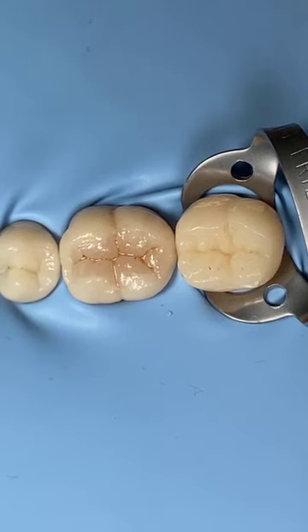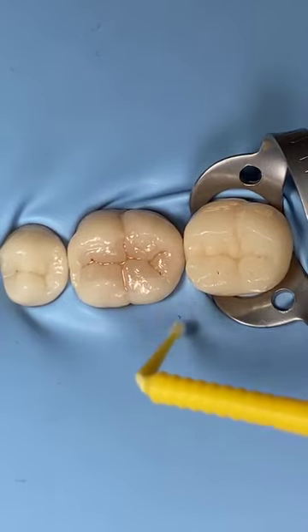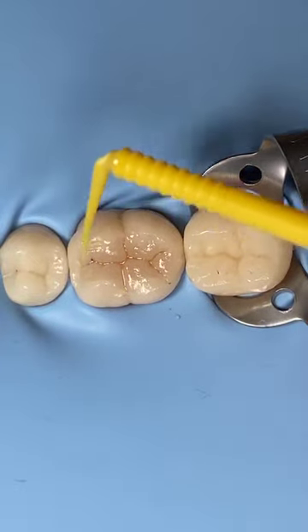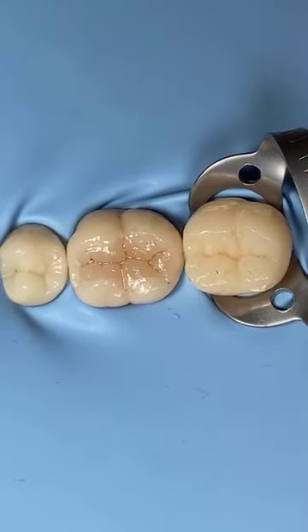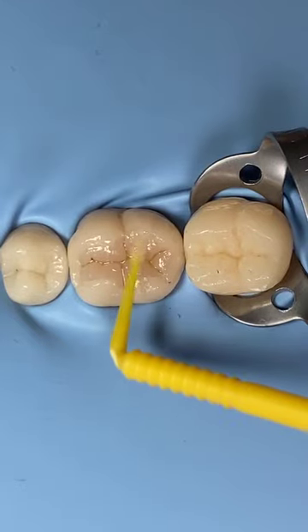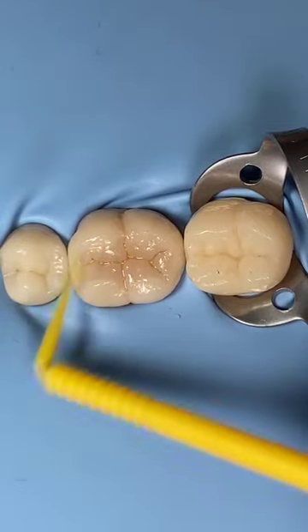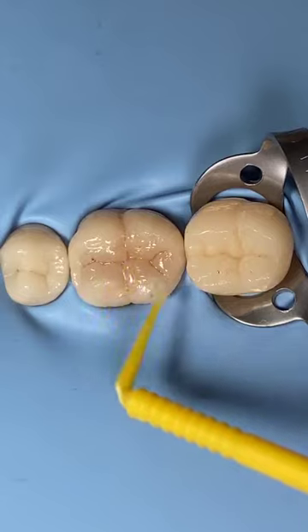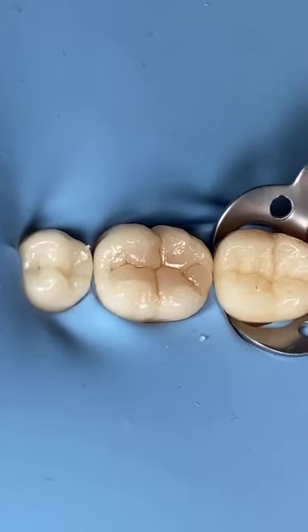Just trying to remove all. Yeah, if you have already created correct fissures, whatever you try to remove all the stain, this is impossible because the stain already goes through underneath the restoration to close all the gaps. So whatever you try to remove all the stain, it will not happen, because your stain goes underneath. It will not remove all the stain. See how natural it is.